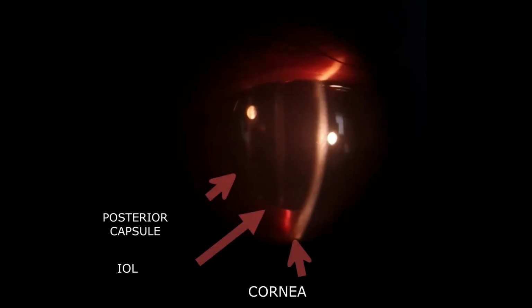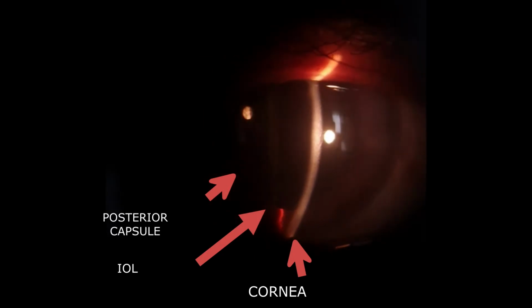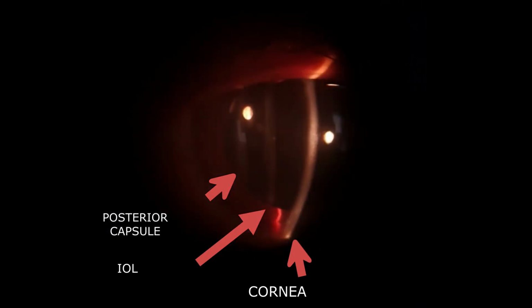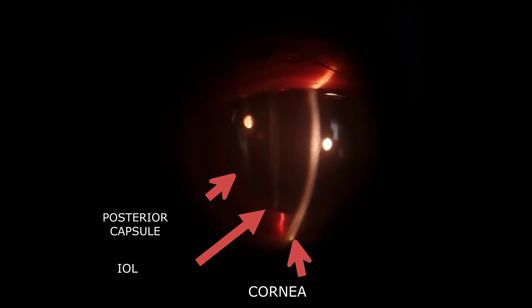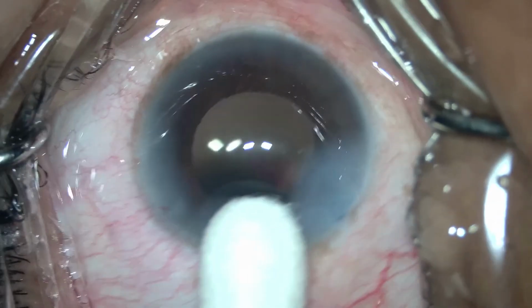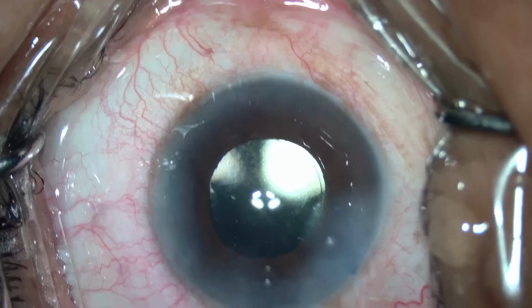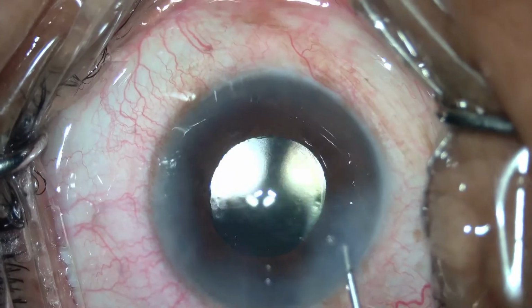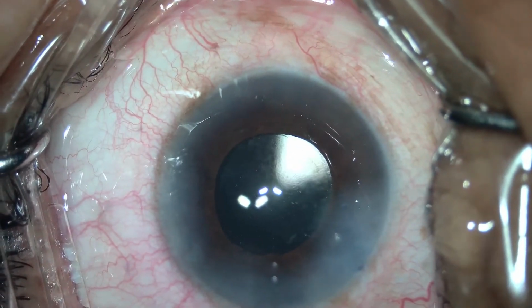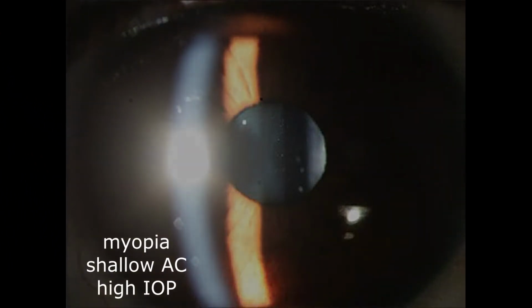Early capsular distension syndrome, that is in the first few days after surgery, often goes undetected. This results in a myopic surprise, shallow anterior chamber, and occasionally raised IOP. Misdirection of BSS into the bag during hydration of the wound at the end of surgery is an important contributing factor. A careful slit lamp examination is all that is needed to pick up this issue.